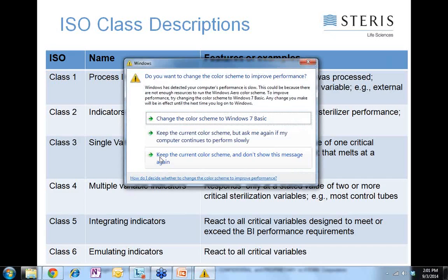These CIs utilize a steam-sensitive chemical indicator in porous barrier or challenge material, usually a paper in most cases, as you can see in the bottom image there. The test serves as a heat sink in an otherwise empty chamber. So to test the sterilizer, you place one test pack in an empty chamber directly over the drain and run the pre-vac cycle. Once completed, you basically unwrap the indicator and view the color change. Any air not removed during the pre-vac cycle will be concentrated in the test pack, and residual air prevents steam contact with the chemical indicator, which obviously would prevent the color change.